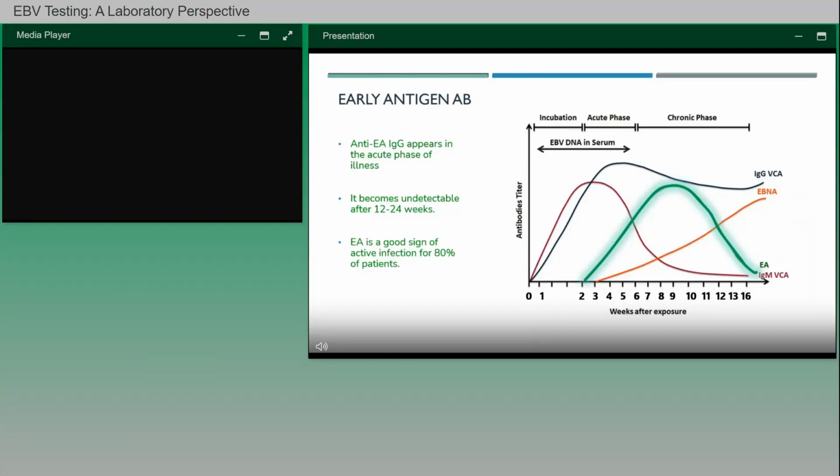But there's a lot of proprietary information. People don't always tell you exactly what antibodies they have against these proteins or what proteins are eliciting their antibodies. But you can look that up for further reading if you're interested in the difference between the diffuse and restricted. But we call the whole pot EA antibodies.